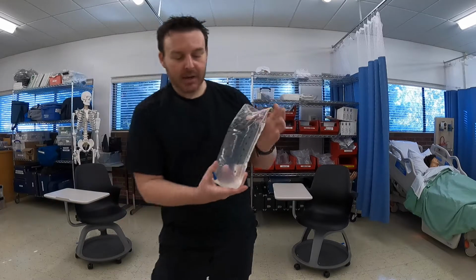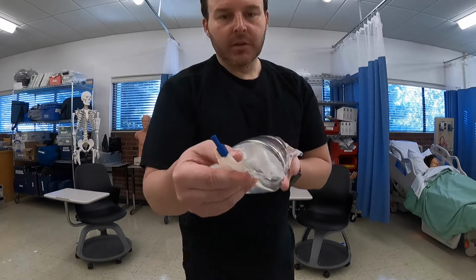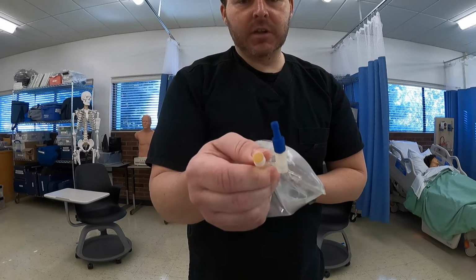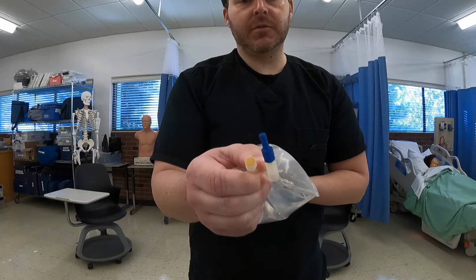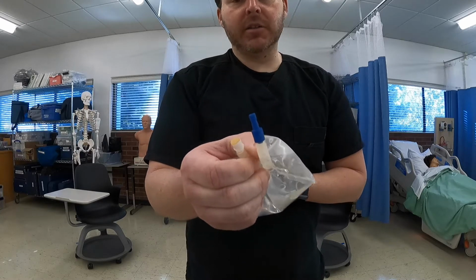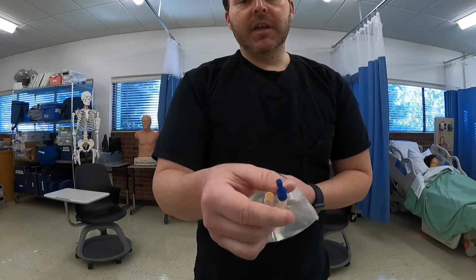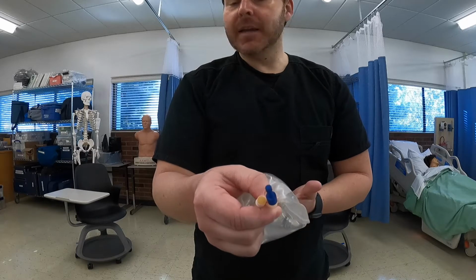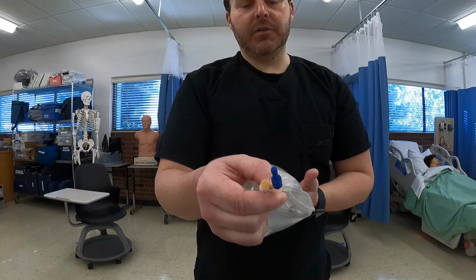On this IV bag, you're going to want to note these two different ports. So you can see you have the blue tab and then this other tab right here. This one is going to be for if you need to inject additional medication, you can inject it through this port. Not something we do regularly, and we won't be doing it during this demonstration. This blue portion is the portion where we spike the bag using our tubing and therefore hook it up and get it set for the patient.